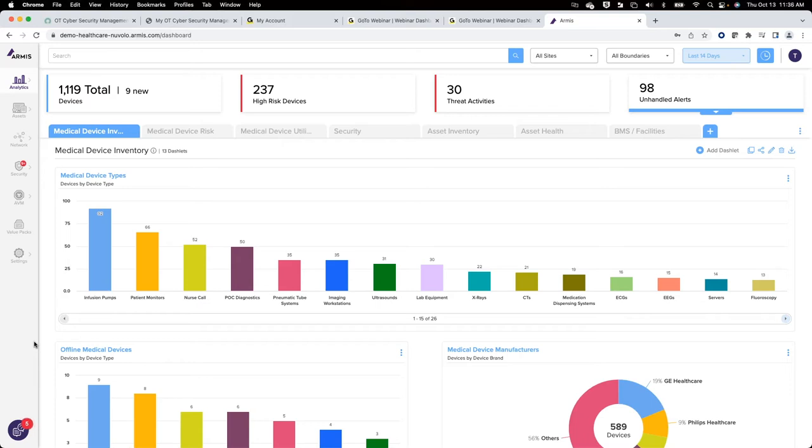Yes. Question in regard to some of our MRIs that have a VPN active. Will you be monitoring that if it's an open line, or we have the remote-assisted control panel? So that communication that's going in and out, you'll be monitoring that? If the traffic is coming in and going out, yes, we can see that. You'll deem that a threat and shut it off? I mean, well, no. Why would it be a threat? Well, I mean, is there a vendor accessing equipment to download logs and files that sometimes might have some information?